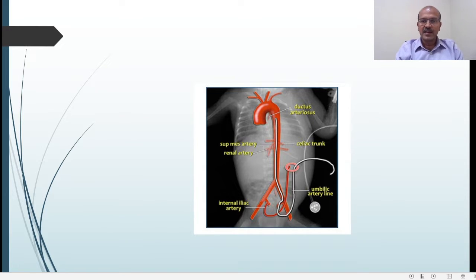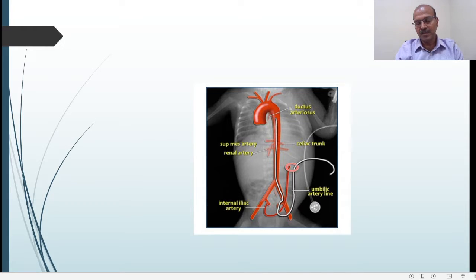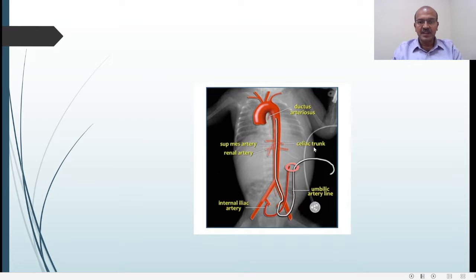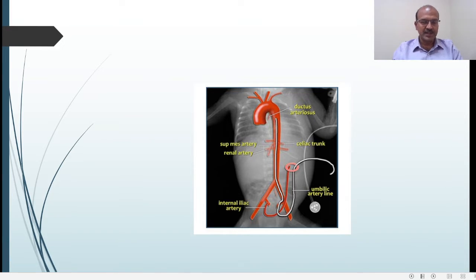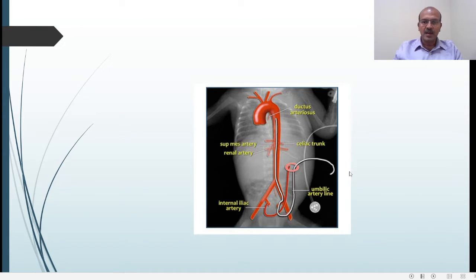The umbilical arterial catheter is inserted mainly for blood gas sampling and also for invasive blood pressure monitoring. It's very valuable in the management of very sick babies, including extremely premature babies where sampling would be very difficult without the UAC. We tend to keep it for the shortest duration possible — removing it when sampling needs reduce and the baby is clinically stable. In extreme premature babies we sometimes keep it for 10 to 14 days, but that's the upper limit.